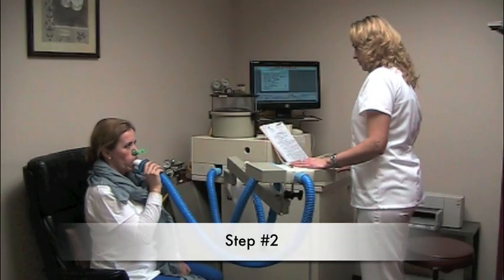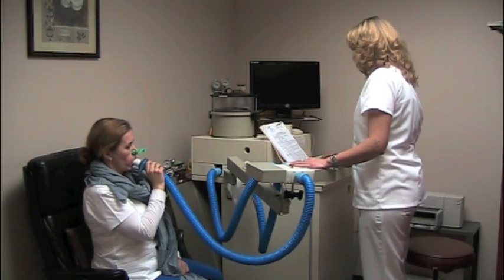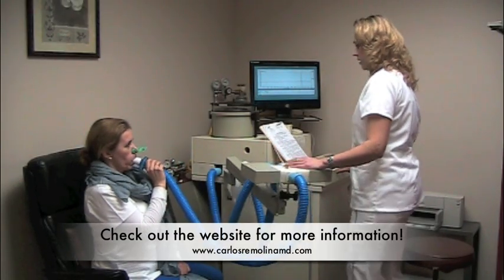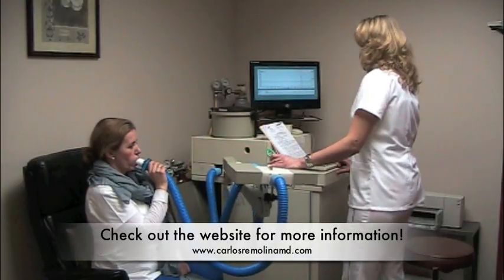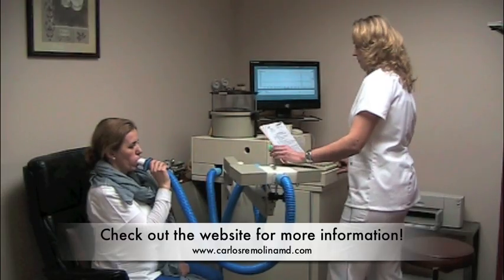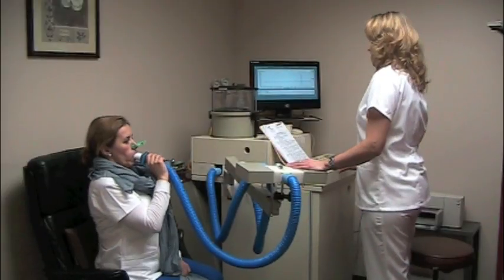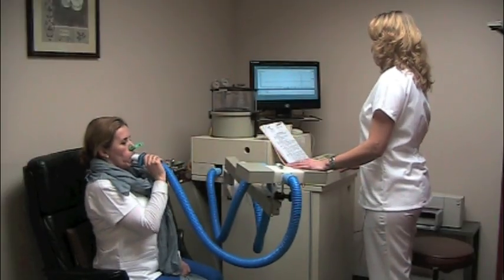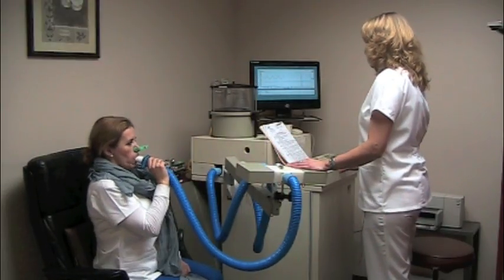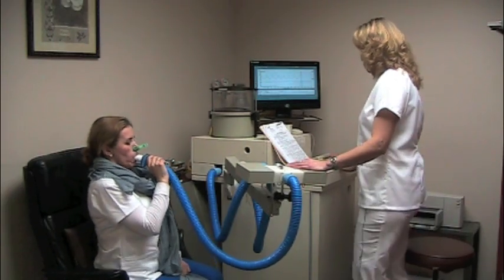The next step: the patient is going to breathe. Breathe normal. Now please breathe deeply and rapidly. Go ahead. Keep breathing. Very good. Almost done. Thank you.